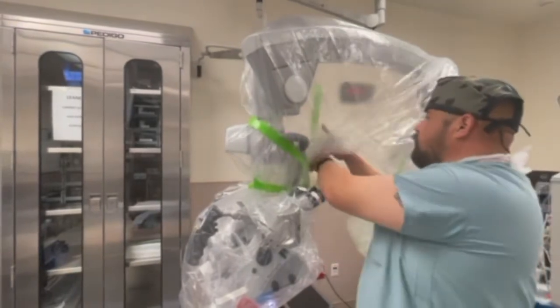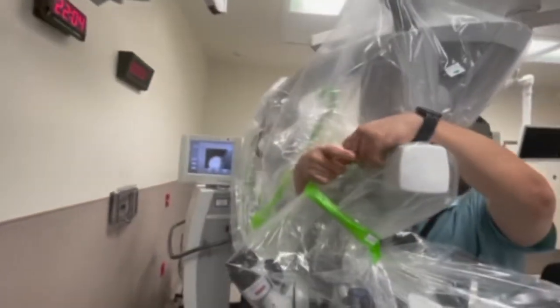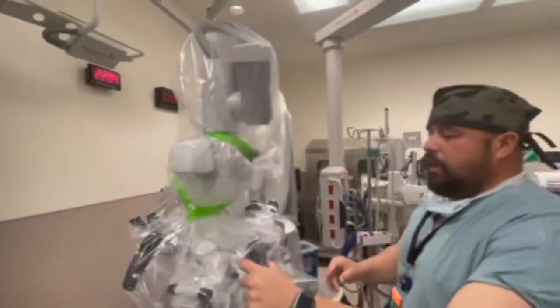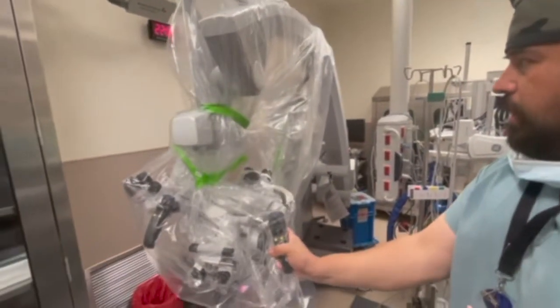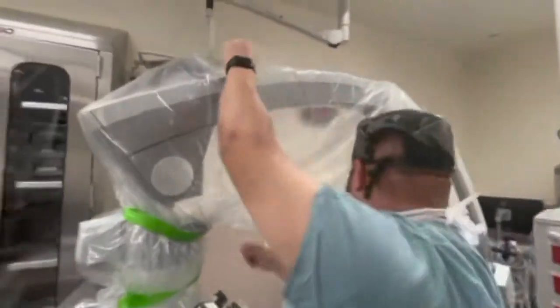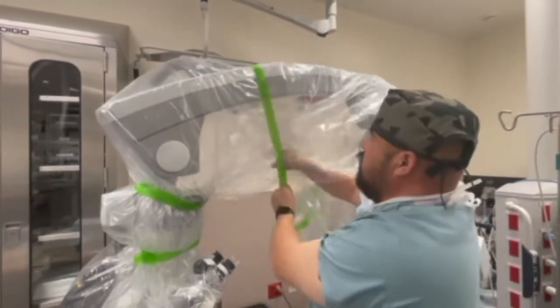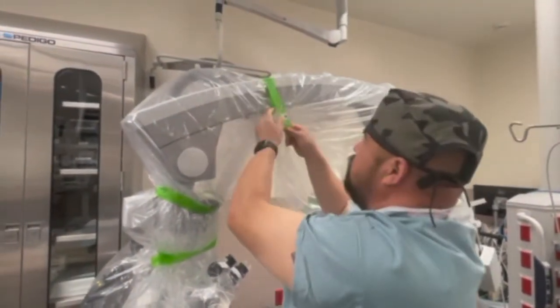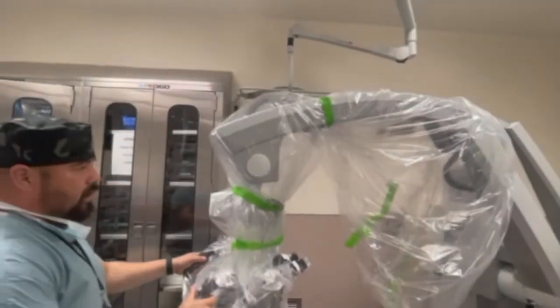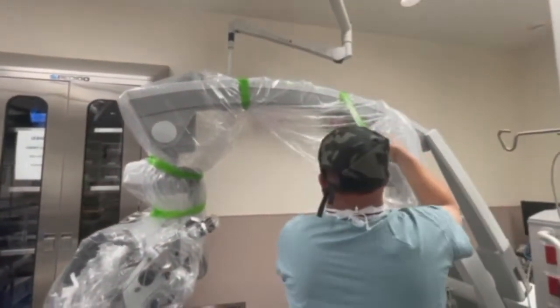You have a choice. If you're not as tall, you have a choice to move the scope down or up. For those that are a little short, you grab the hand control and you move it down, like so. And then you move on to the next green sticky. You wrap it around the scope. This part you can do really tight because it's going to help with the suction. Then you can move it back or you can leave it how it was. I'm okay if I move it back. So I wrap it pretty tight.